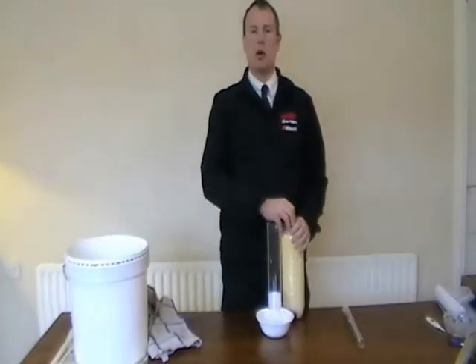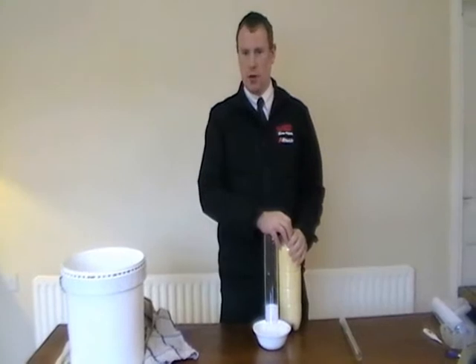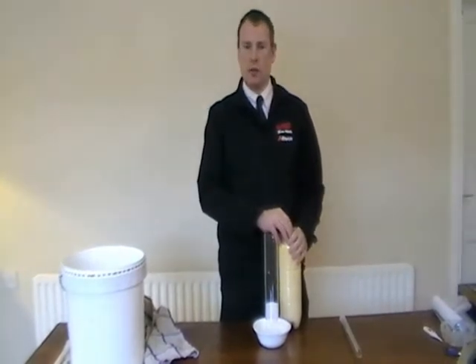When testing colostrum, it's very important that it's tested at room temperature. This will give you a much more accurate reading from the colostrum tester.